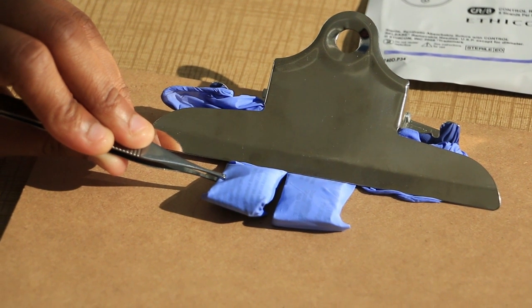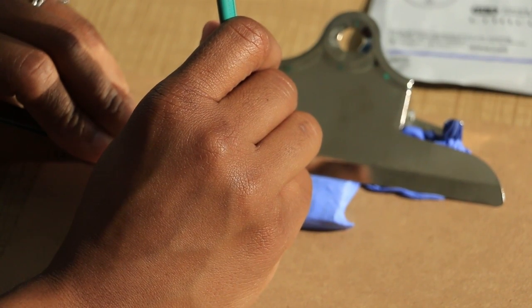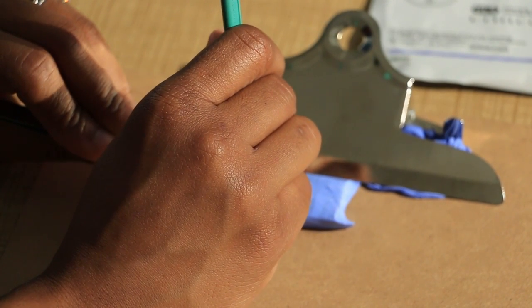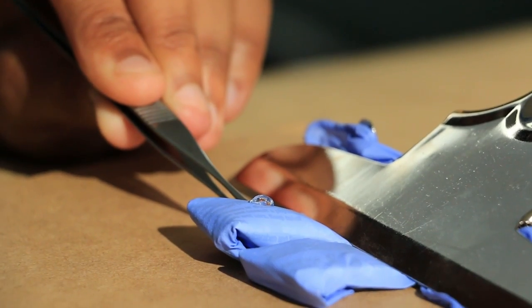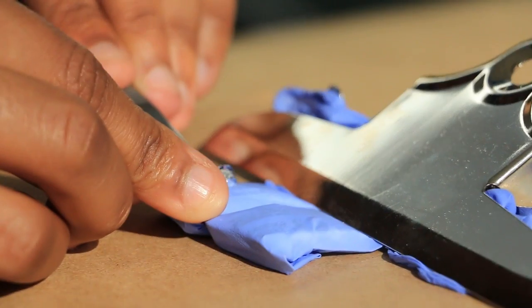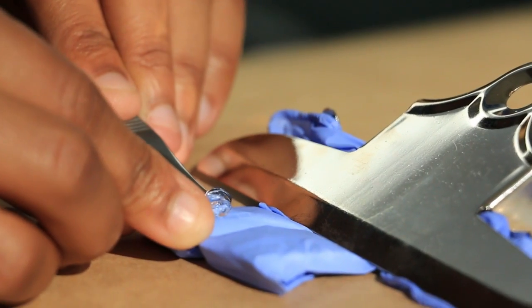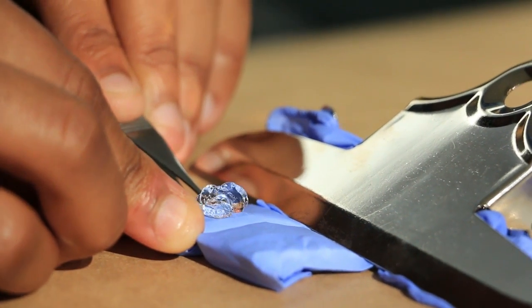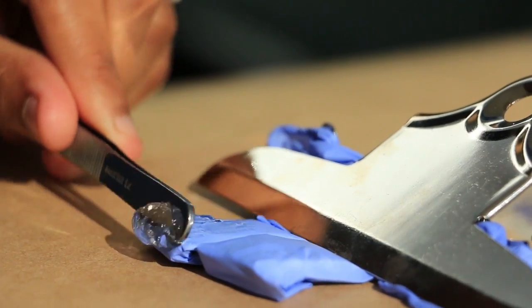After sterile preparation and the administration of a local anesthetic, the wall of the cyst or abscess is grasped with a small forceps and a number 11 blade is used to make a 5 mm incision into the cyst or abscess. The incision should be within the introitus, external to the hymenal ring, in the area of the duct orifice. The incision will rarely be too small — it only has to fit a tube just over 3 mm in size, but if the incision is too large, the word catheter will fall out.